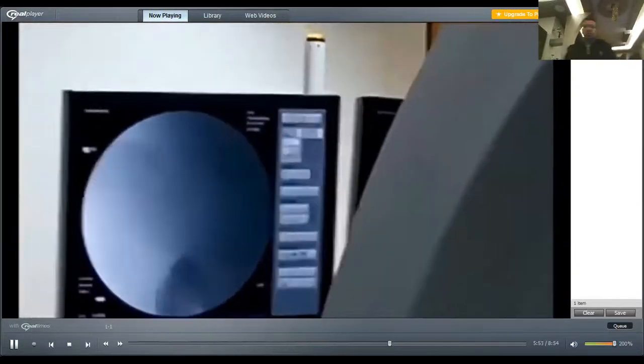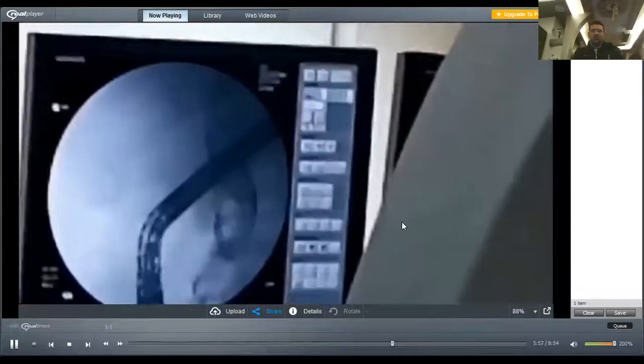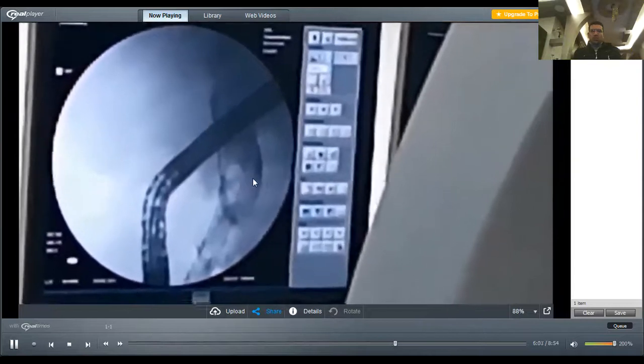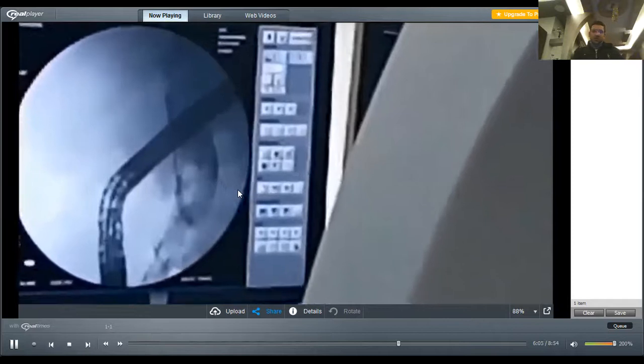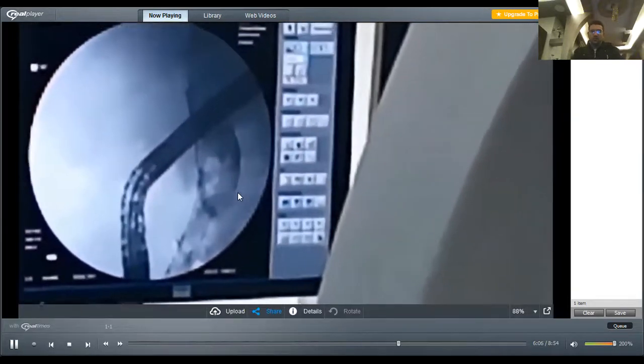After doing cholangiography to confirm this, we showed that something obstructed this stent, maybe mud, maybe a stone, something like this. All of this means that the stent is already obstructed. Now we will try to maintain the guide wire above the level of the obstructed stent.